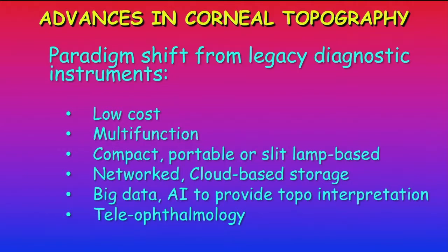We will head toward low-cost topographers that are multifunction. They're compact, portable, slit lamp based, and networked, and store all of their data in the cloud, providing the opportunity for big data analysis, for smarter, more effective screening programs, and finally, to open up corneal topography as part of telemedicine.